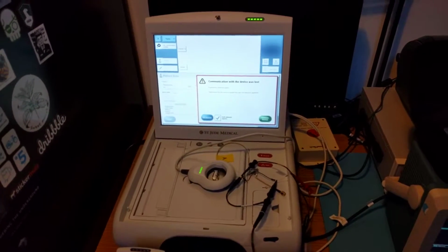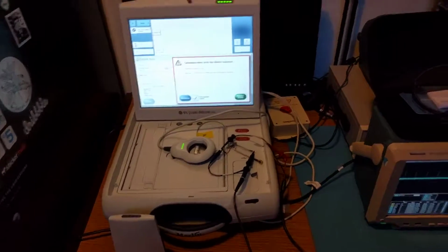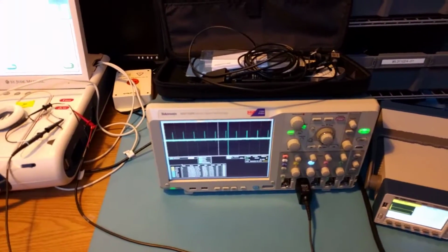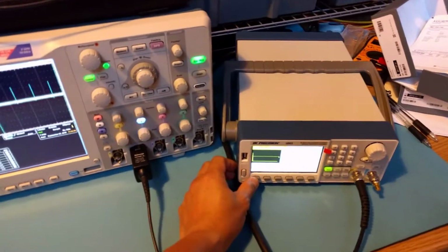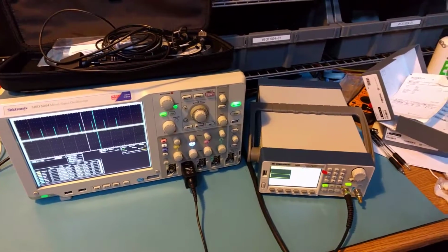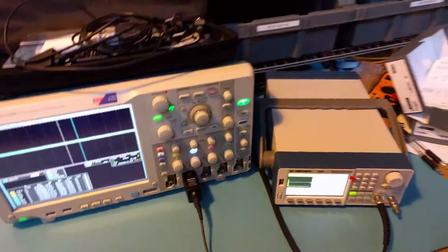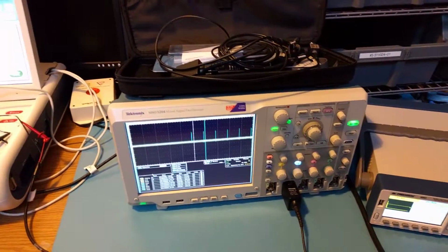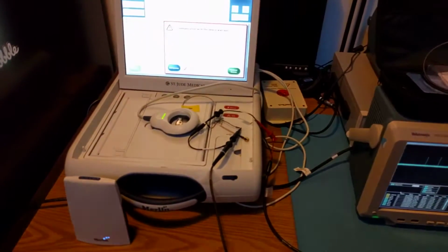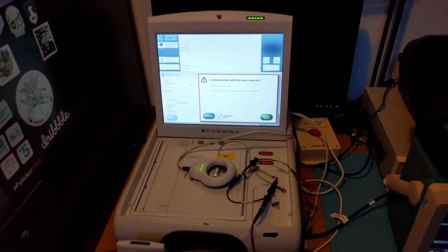and there we go. We have the communication lost message to the pacemaker, and we can verify that the pacing is still continuing in that case. Again, if we do enable the simulated cardiac signal, we see pacing inhibition happening on this line, and then when we turn the simulated cardiac signal off, the pacing resumes, just as expected on the clinical side of the pacemaker, although there is no telemetry going between the pacemaker and the programmer.